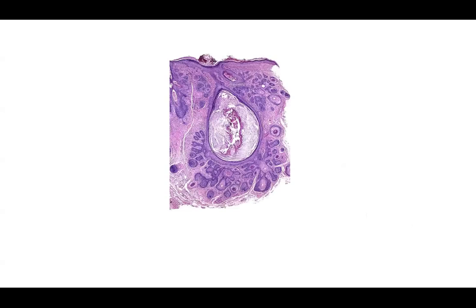Take a look at the structure of this. What type of process do you think it is? Do you think it's an inflammatory process, neoplastic process, a cyst, or a deposit? What's your diagnosis?